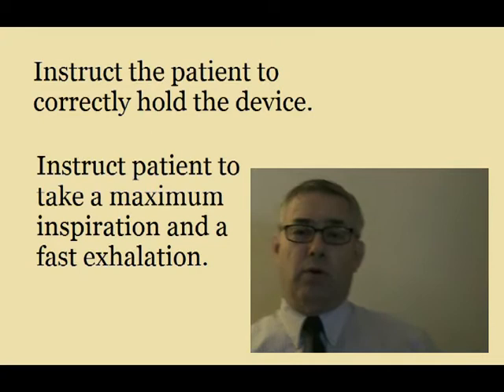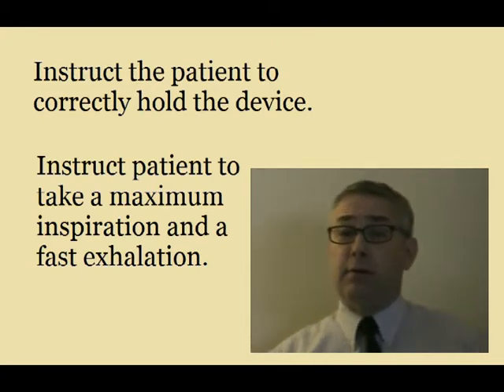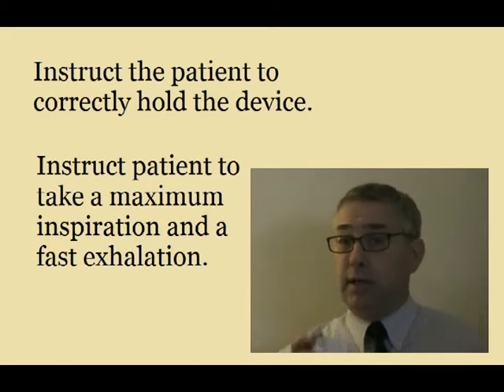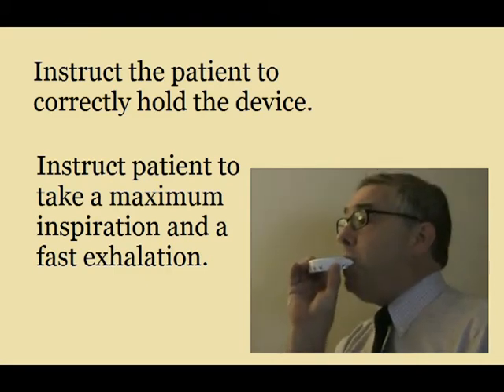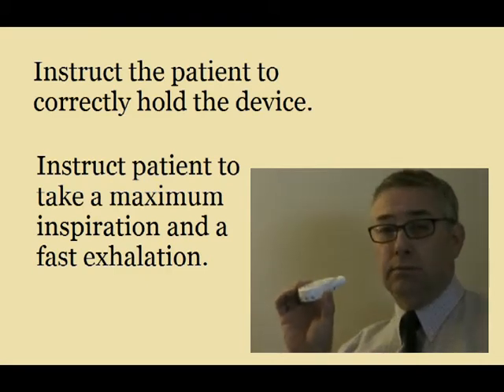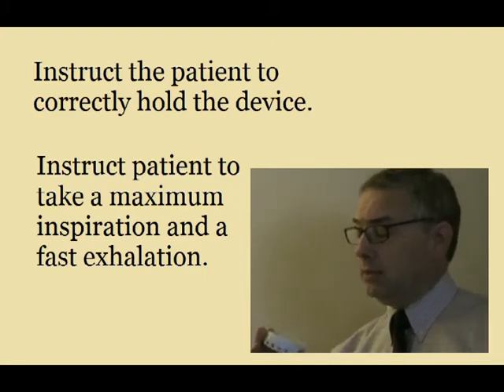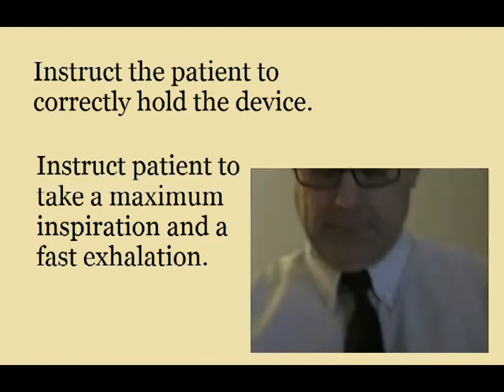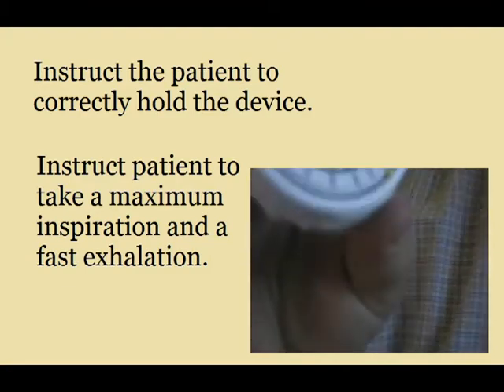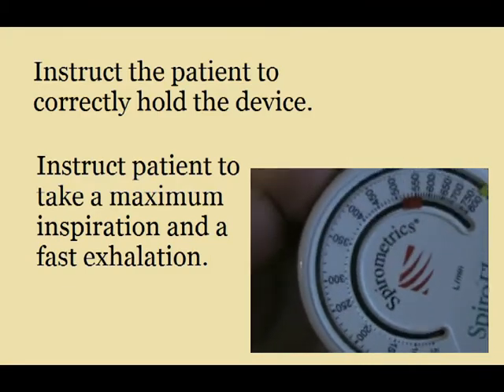Then, what we're going to do is have the patient take a maximum deep breath in, followed by a fast exhalation out. Big breath in — fast exhalation out. You're then going to go and look at your peak flow meter and look at the reading. In this case, it is about 550.